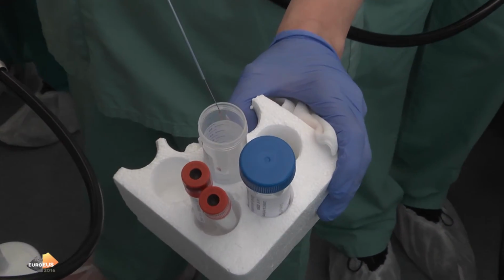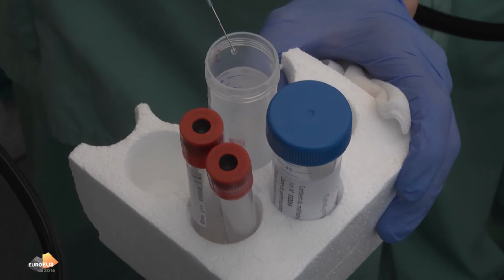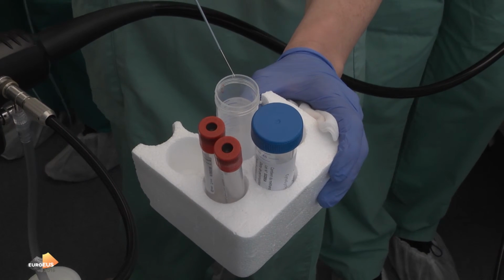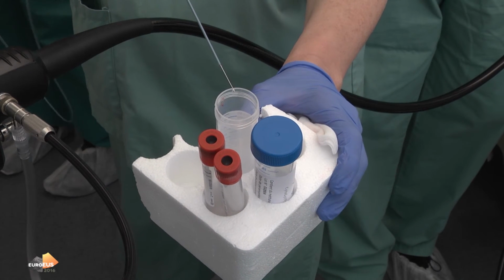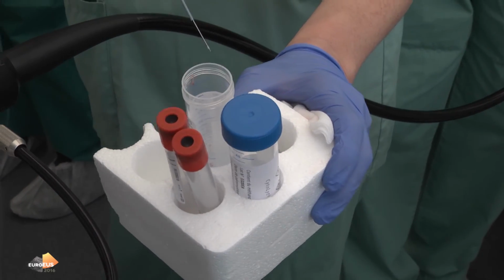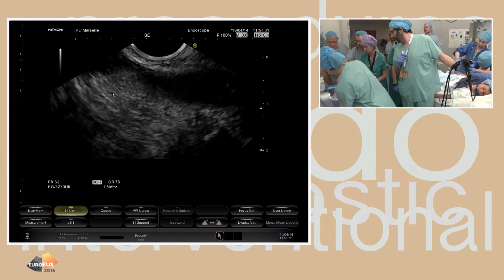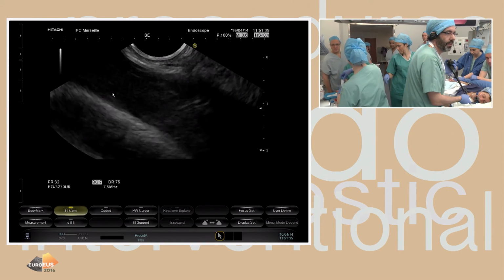So this is also important whenever you manage the sample, it's like mucin because it's like jelly, but here it's not absolutely liquid. Okay, but there is a sample here, no? Ah, yes, here. We have a tissue. Okay, it's also good. Perfect.